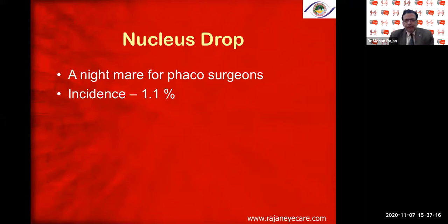Nucleus drop, as you know, is a nightmare for phaco surgeons. The incidence is about 1.1 to 2%.